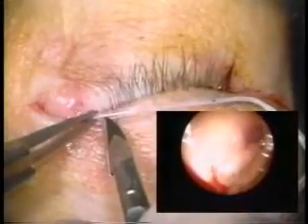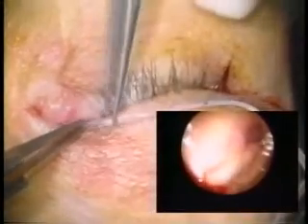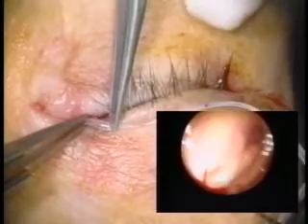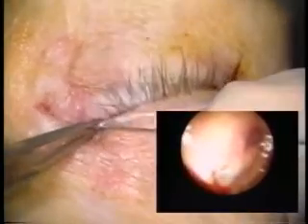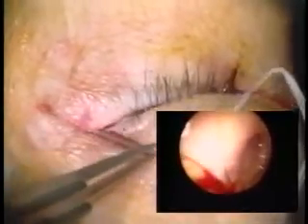The tip of the tube does not appear from the opening of the nasal lacrimal duct because of slippage of the metal probe in the tube. A second small cut is created and from the second cut the metal probe is inserted to push the tube. If the tube is the step NST, in which the nunchuck tube has steps on the inner surface, this procedure is not required.